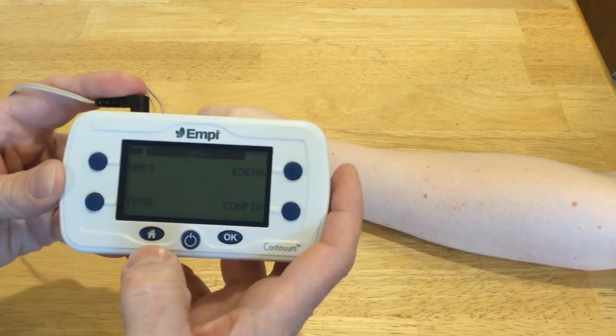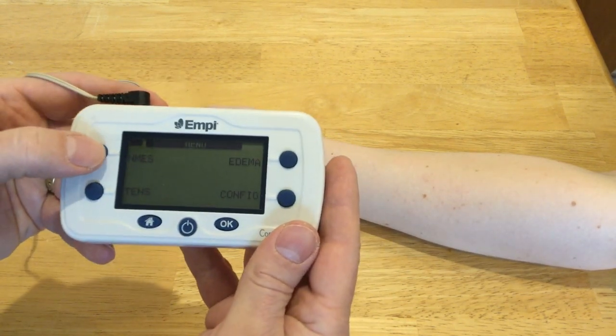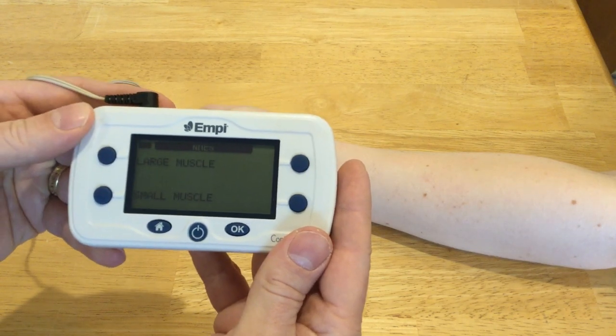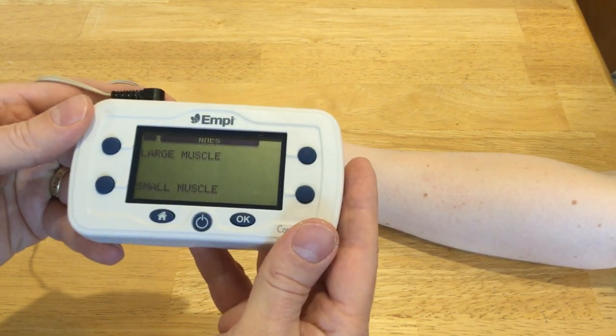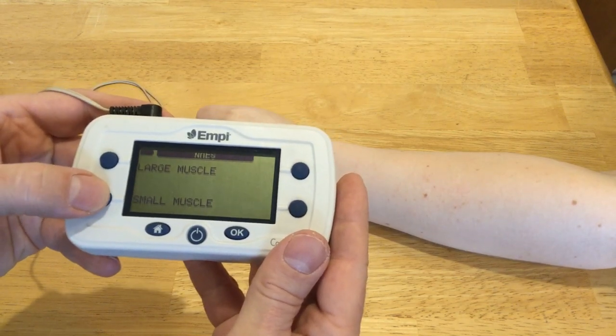It's going to ask what do you want to do. I want to do NMES, so I'm going to pick that. And it says are you going to do a large muscle or a small muscle? I'm going to do a small muscle in the forearm, so I'm going to pick that.